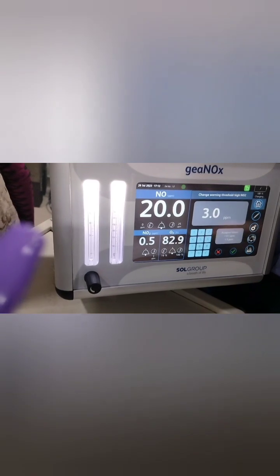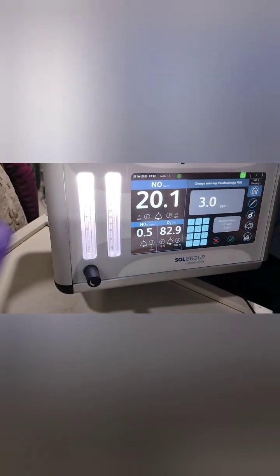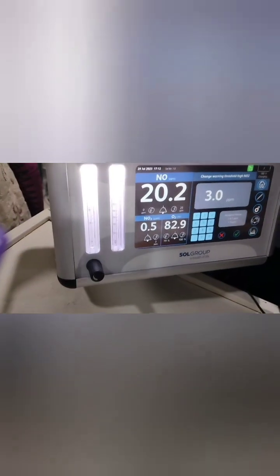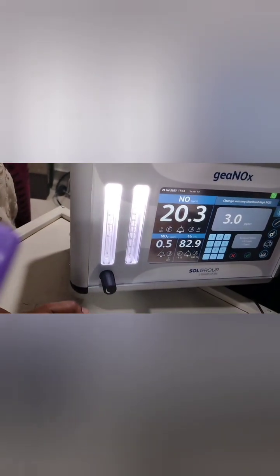The iNO delivery system independently measures the oxygen the baby is receiving, and you can cross-check this with the oxygen cell on the ventilator as well. Both readings are available for comparison.